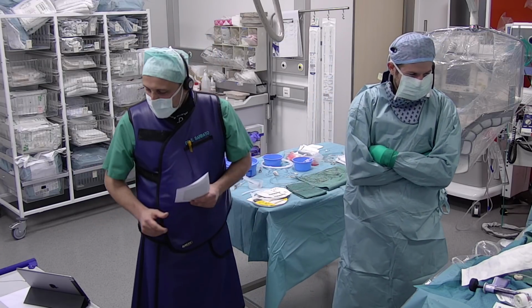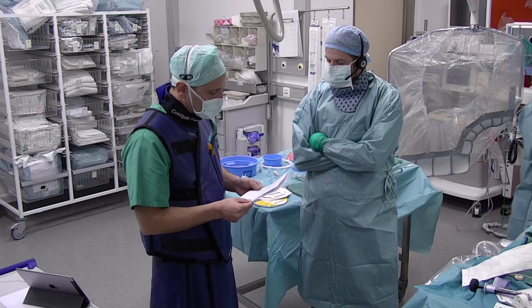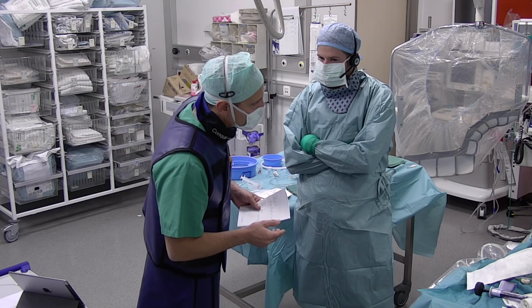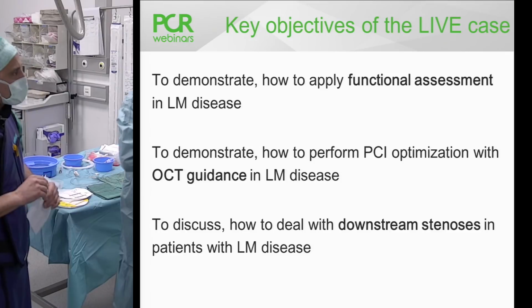I think, Gabor, we are almost heading to an end. We shall perhaps wrap up and give some key messages. I see that Bernard is closing the access. Do you want to just wrap up?